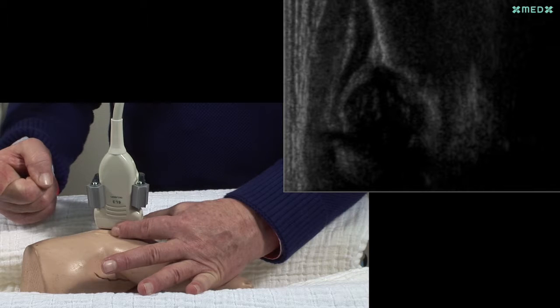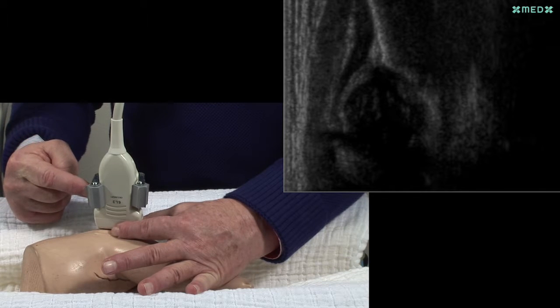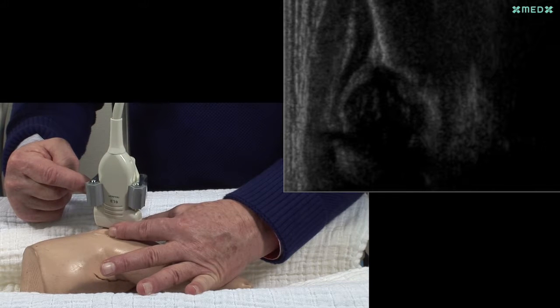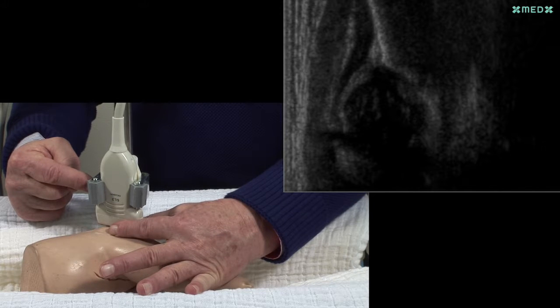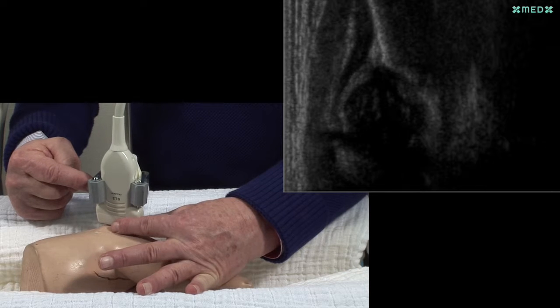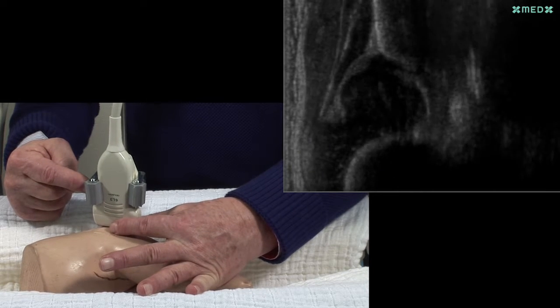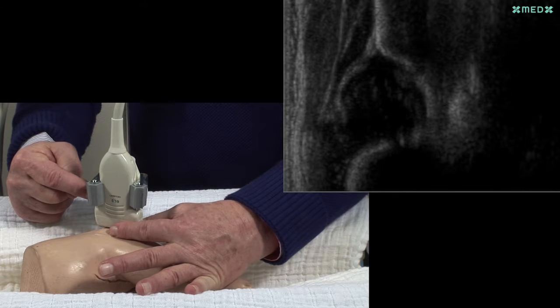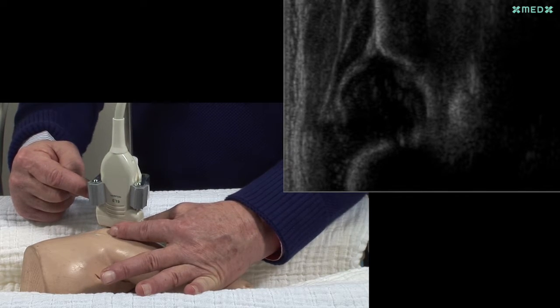With the finger of the right hand, the correction of the plane is done by rotation. Then, with parallel movements forward and backwards with the left hand, the lower margin of the ilium is fixed again. When the lower margin and the plane are correct, in this technique the labrum comes automatically.